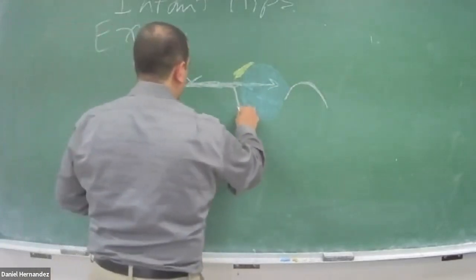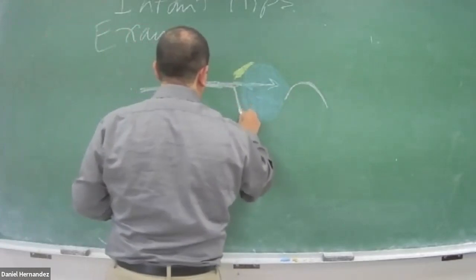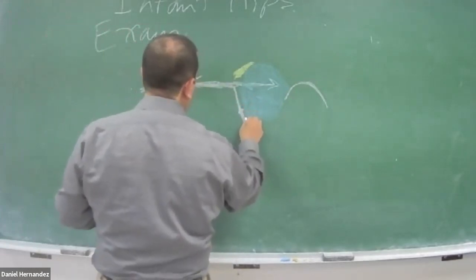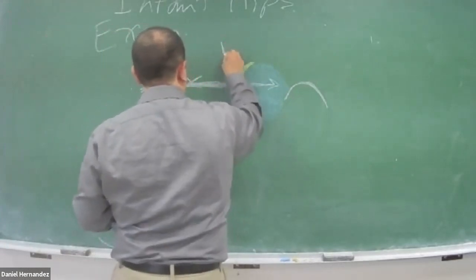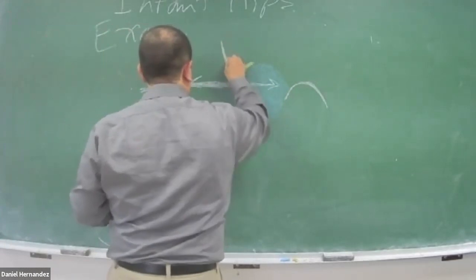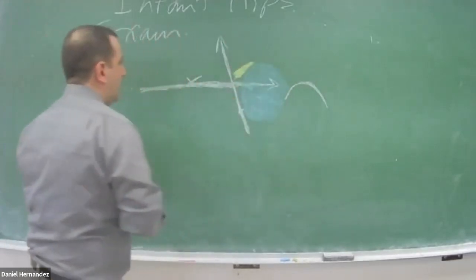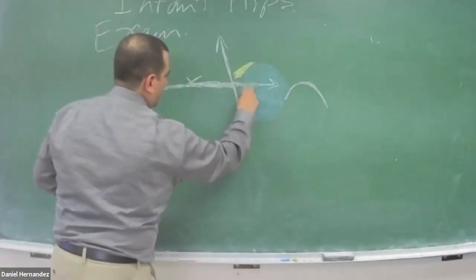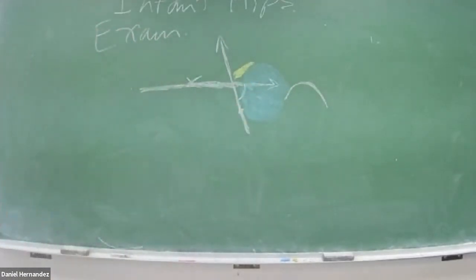And then you're going to have another caliper that you line up another line. You put a caliper into the acetabulum, and you're going to extend it upwards. And you're going to try and calculate the angle between the femoral head and the acetabulum.